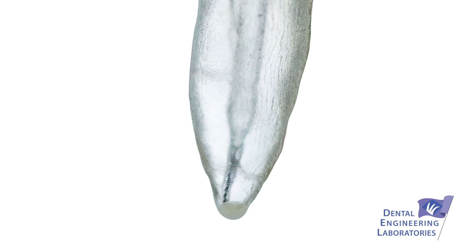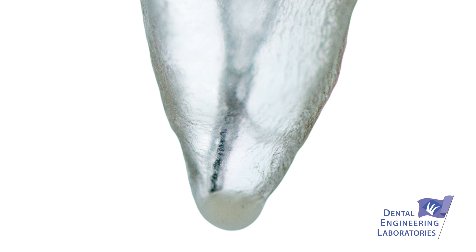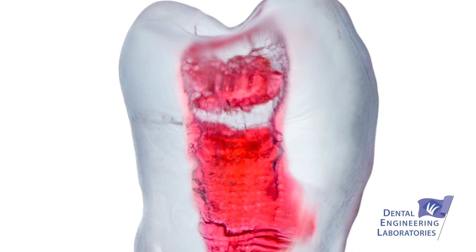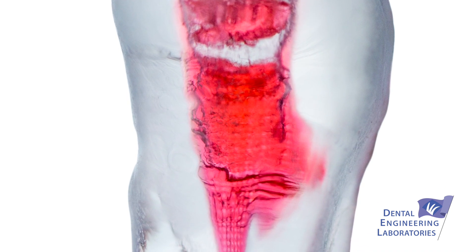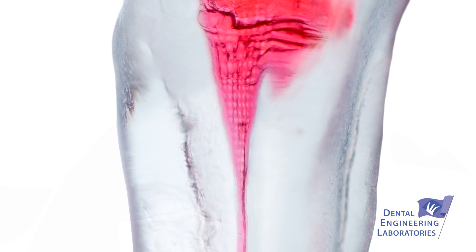The pulp space is made out of a different material than the hard, heat-resistant material that makes the root structure up. You can see it's got a different color, and it feels soft to the file, so that part is an accurate replication as well.